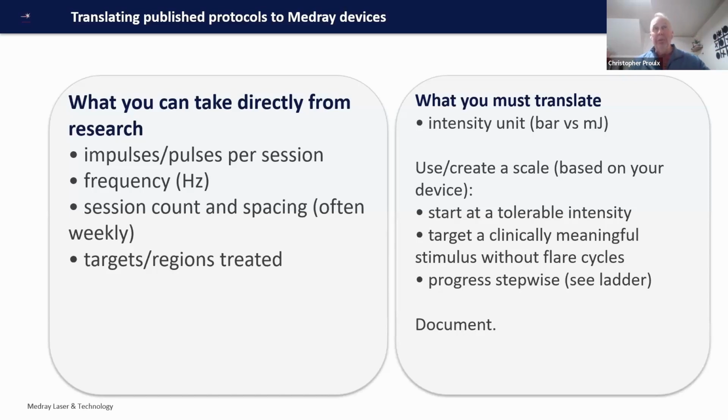At least today, we're still seeing that patient tolerance is a really good indicator of the potential higher end of the benefit, right? So that's sort of the upper echelon of the spectrum. And then what do we know below that? Well, we actually know that you do not need a lot of energy to create a biological response in the tissue. And that's very important to understand because, what I say is you don't have to kick the crap out of your patients just because the literature is such.